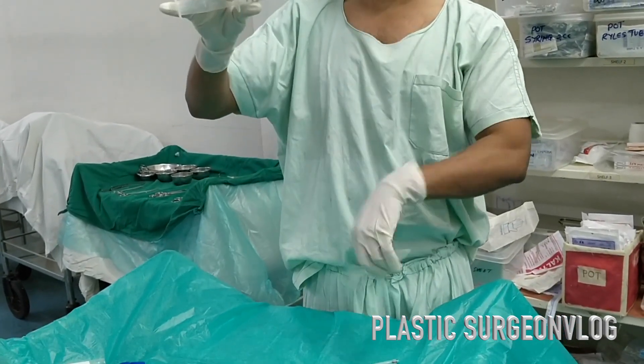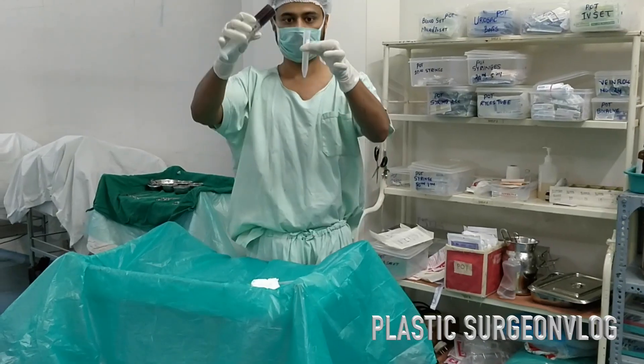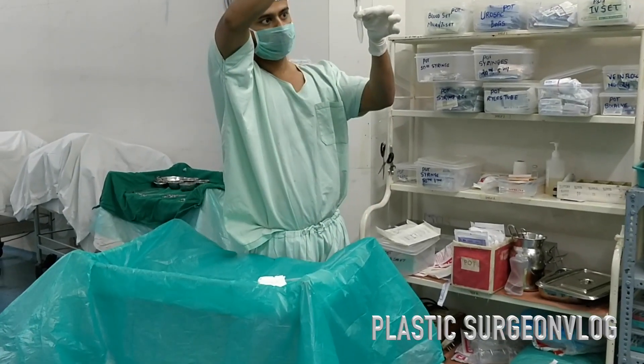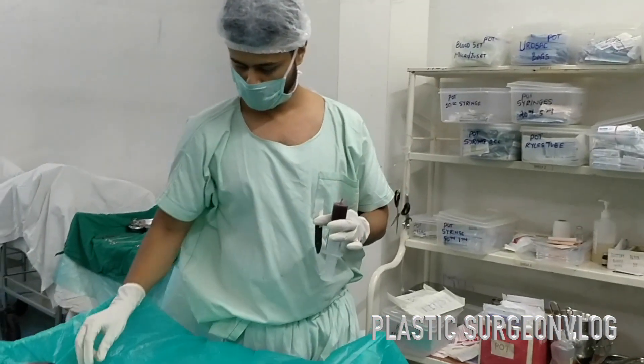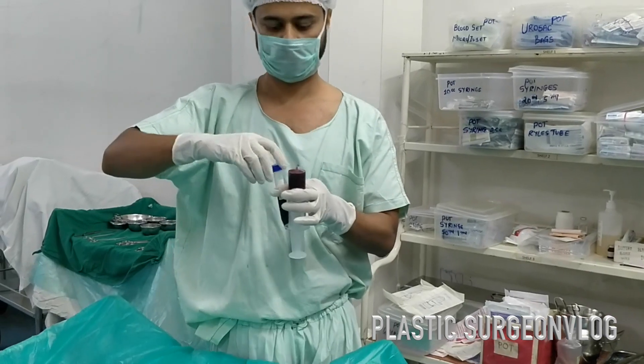I have already collected the patient's blood in an anticoagulant solution, and now I am putting this patient's blood into the falcon test tube for the process of centrifugation.